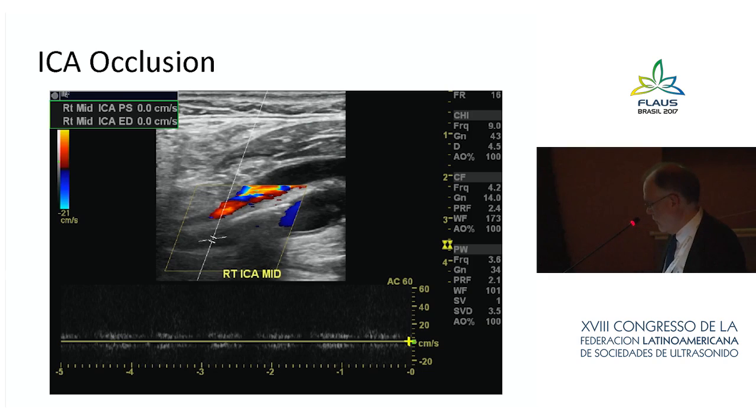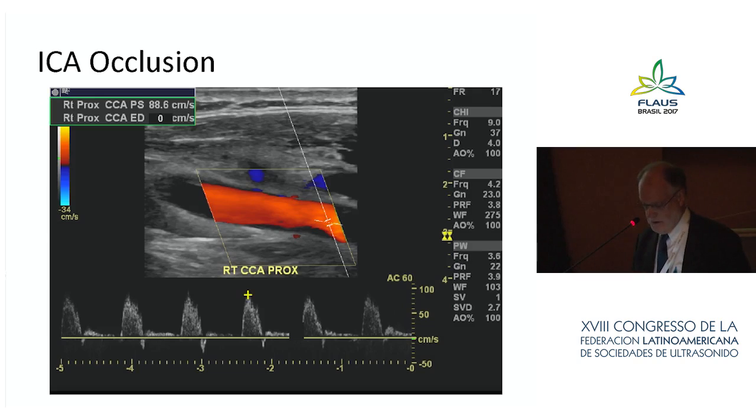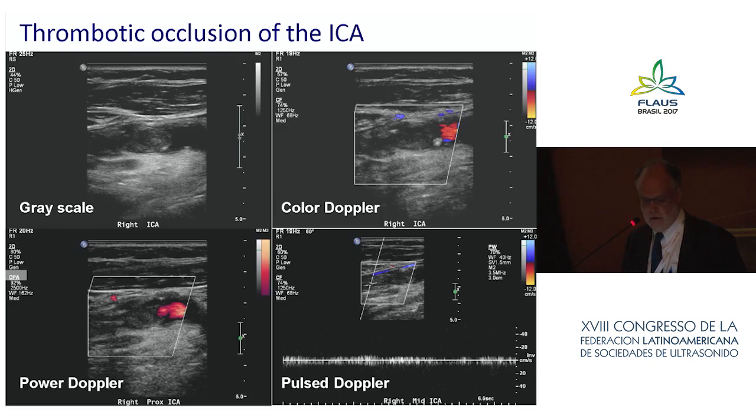So here's a carotid occlusion. This is the internal carotid artery here. There's an echogenic plaque here, and no Doppler flow detected distal. And so here's the common carotid artery in the same patient. Again, really absent diastolic forward flow, which is a finding we would expect to see. And this is, again, where you want all of the images from the carotid artery, ipsilateral and contralateral, to support the diagnosis that you're making in these cases.